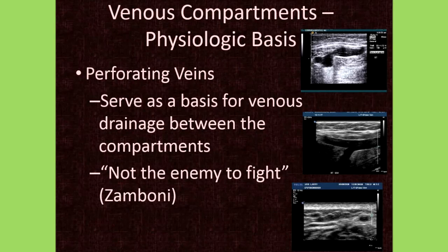These are some examples of the perforator veins. The image on top is a very large perforator. The one in the center is likewise a large perforator. And on the video clip, that's a small saphenous vein with a perforator.